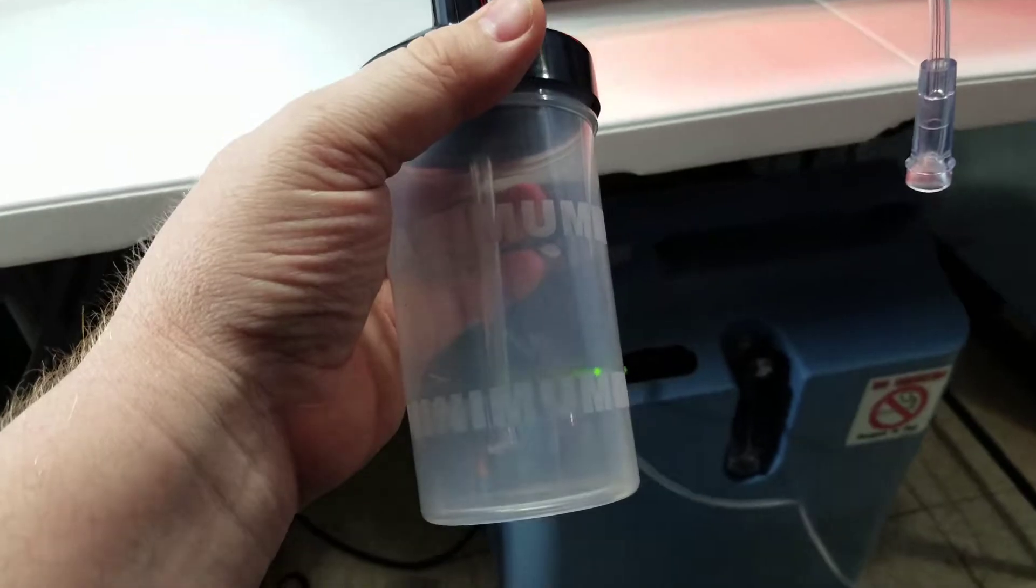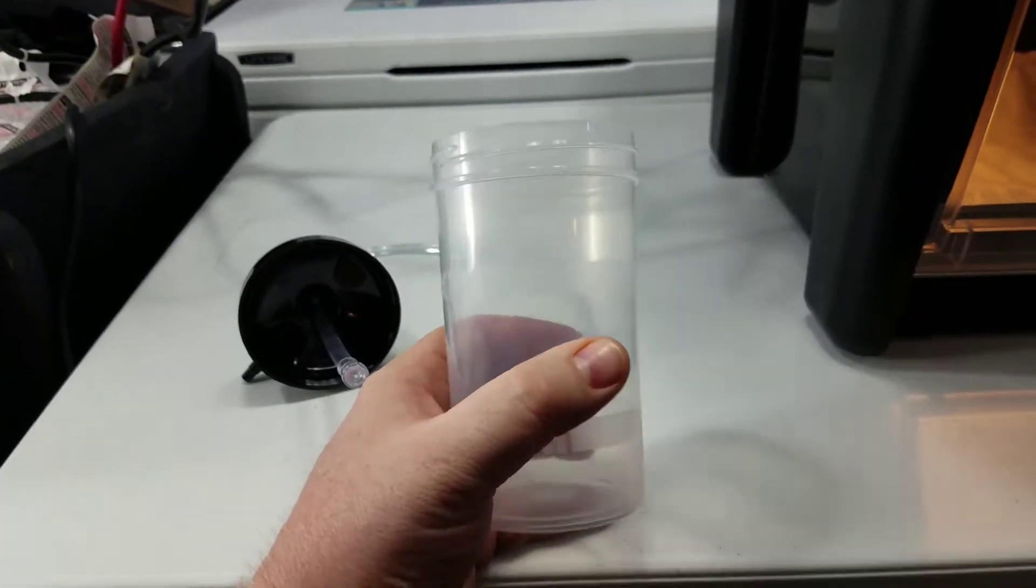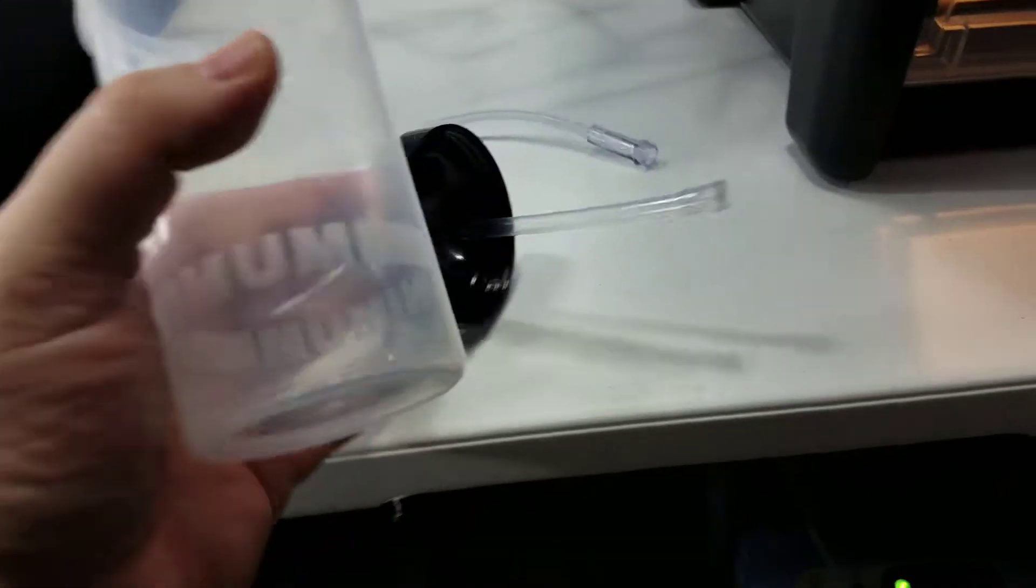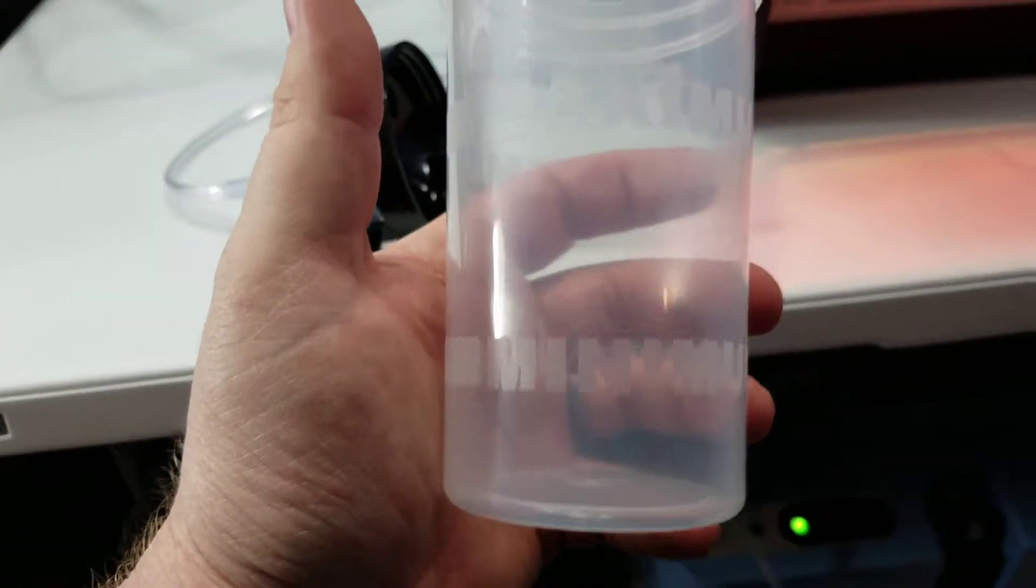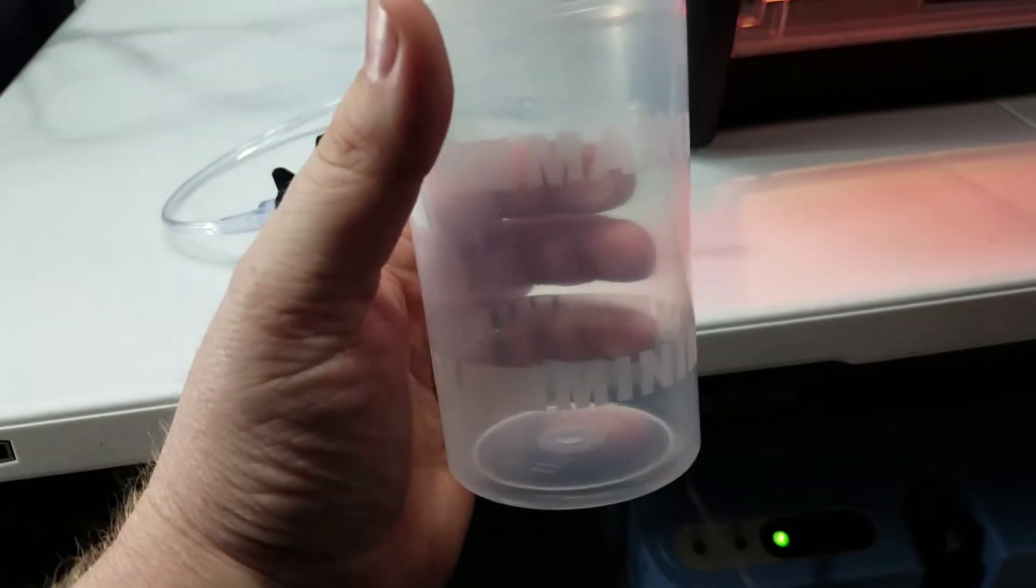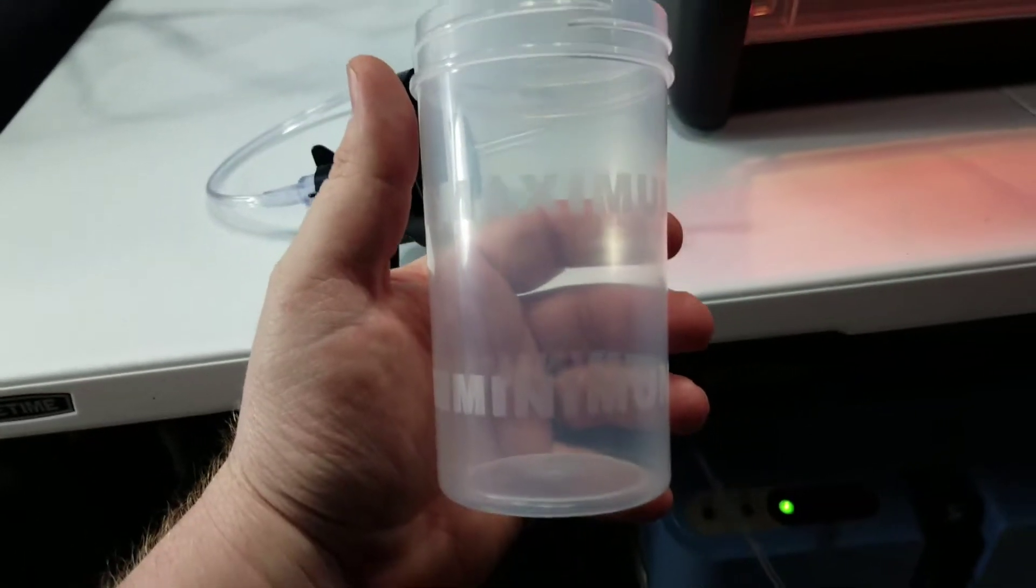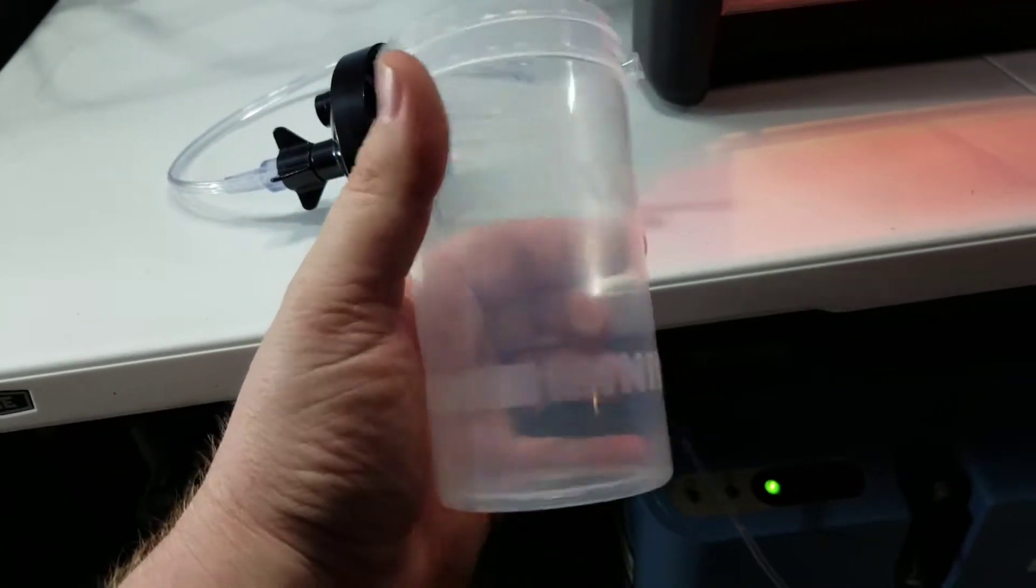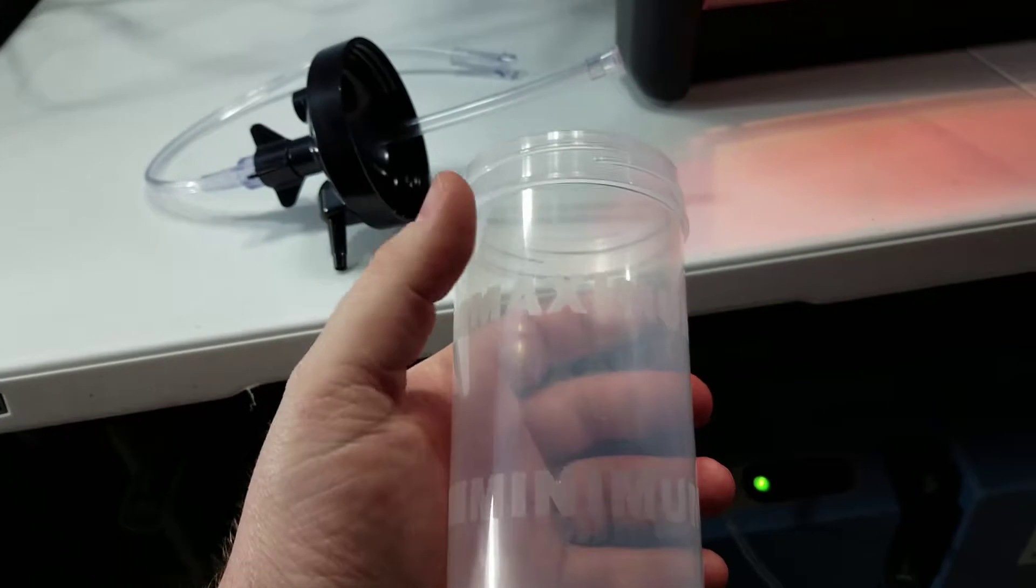Before I filled it up with water, I thought I would just show you real quick that the black top unscrews from the cup here and you've got two lines - a minimum and maximum. You want to use distilled water in the cup so it prevents any lime or calcium buildup that can affect the operation of the bubbler cup.